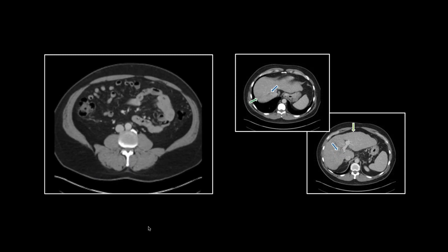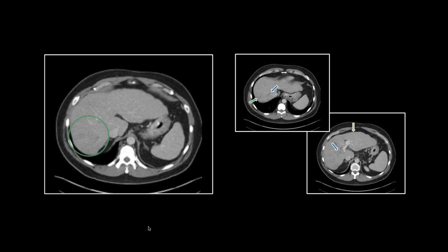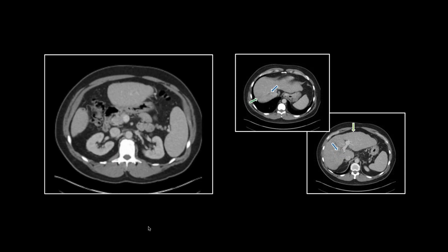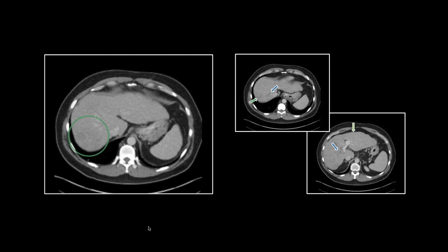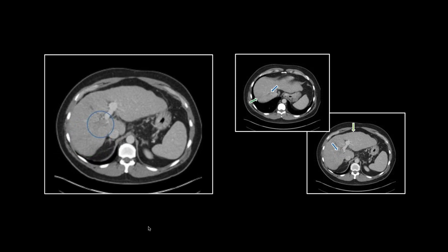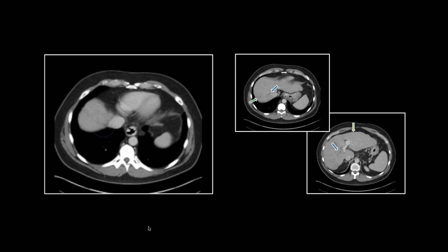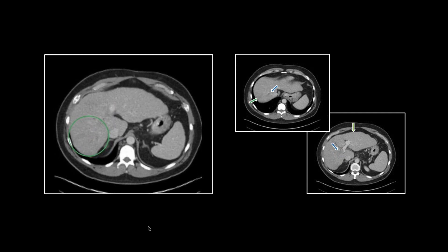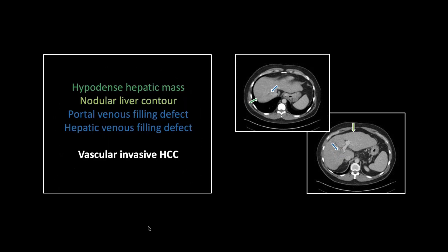In the setting of cirrhosis, if you see a hepatic mass you're going to call it HCC until proven otherwise. With this one you might have said you couldn't clearly see a mass, but then you spot the venous invasion and it leads you right to it. Cirrhotic liver, heterogeneous hypodense irregular mass, plus two venous filling defects — hepatic and portal — pretty much seals that deal. That is vascular invasive HCC.